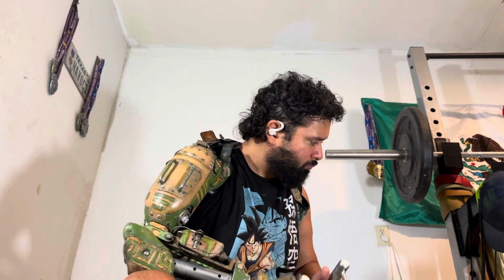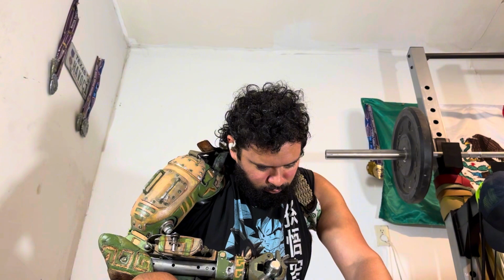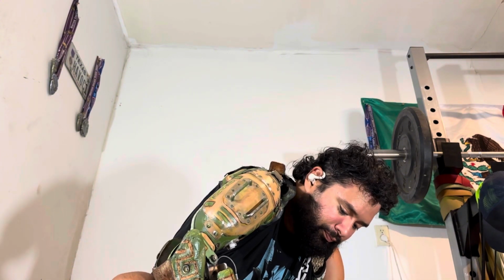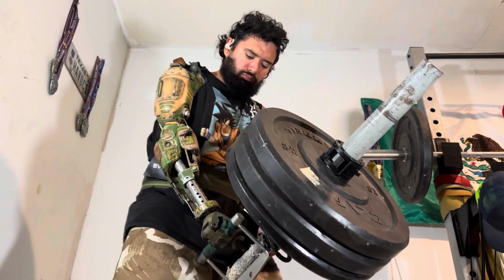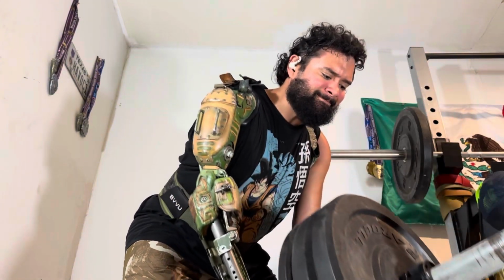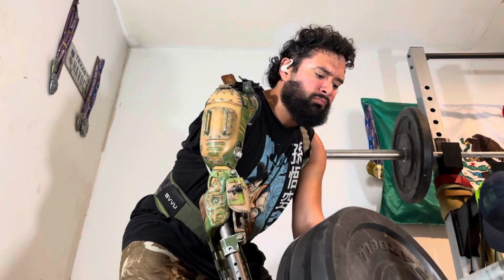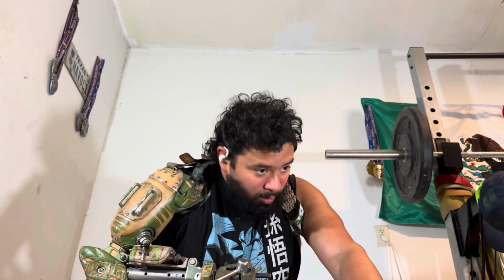And that's to say that almost all knees are metal, right? And this arm is one of the only metal arms, while typically knees are all metal. So to bring something like this to production is, I think, important for all prosthetics, but specifically upper extremity prosthetics, because the other arms that you see me use in any of the videos, like the blue one or the brown one, they're all mostly plastic. And I'm pretty critical of why prosthetic arms haven't evolved alongside knees, to the level where they're all metal.